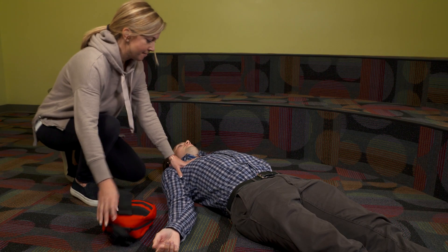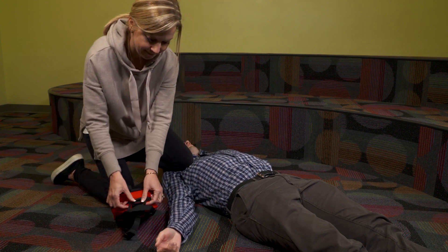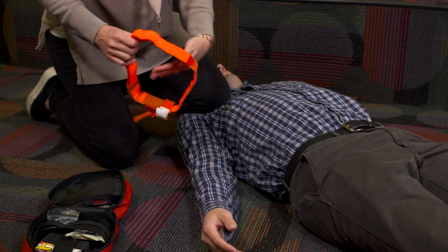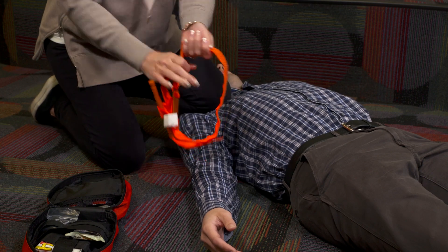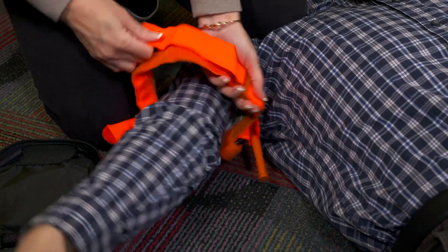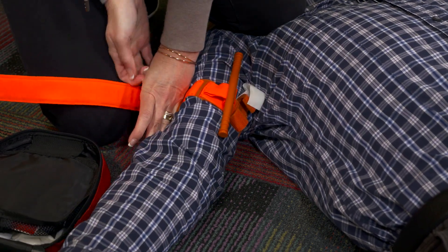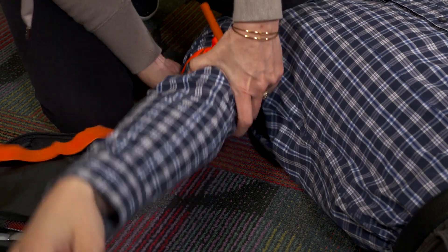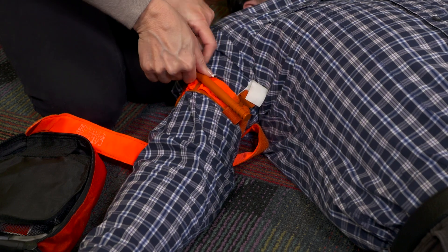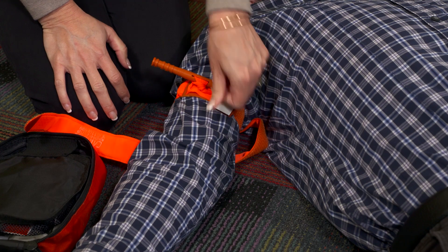There are a few teaching points about tourniquet placement that you have to remember. First, tourniquets hurt, and this does not mean that you've done something wrong or that it's been placed incorrectly. We're compressing good tissue along with injured tissue, and that hurts. Remember, you are applying a tourniquet because you're concerned that they were going to bleed to death. Never loosen a tourniquet, and don't let the patient convince you to stop because it hurts or feels too tight, because applied properly, a tourniquet will hurt quite a bit.